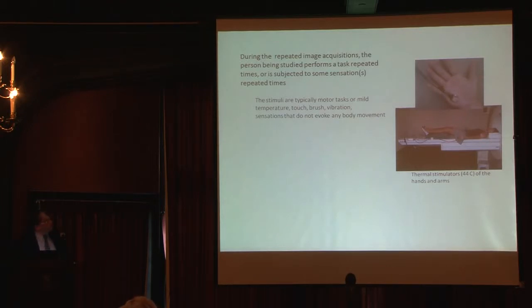So we're limited. A lot of work I do is with thermal sensation. Here's just a picture of our thermode on a hand, just to modulate the temperature, so you get a temperature sensation. Here's a healthy volunteer, a former grad student, happily volunteering for a study. And here are thermodes attached to her shoulder and on her hand. So we can target two levels, two dermatomes in the spinal cord. And we have two other thermodes directly symmetrically on the other side of the body, so we can look at right and left comparisons. Within each we do a 7-minute fMRI run. And so we're looking at 4 different dermatomes at the same time and the distribution of activity they produce.